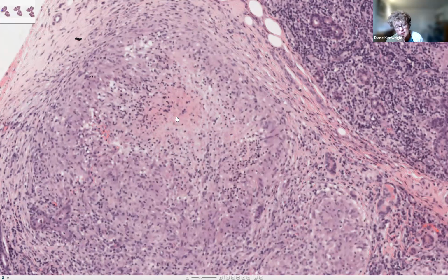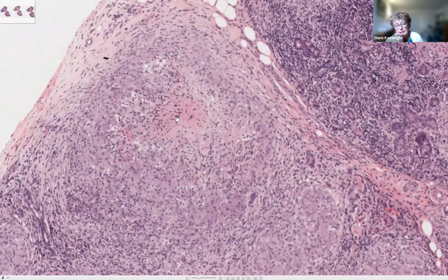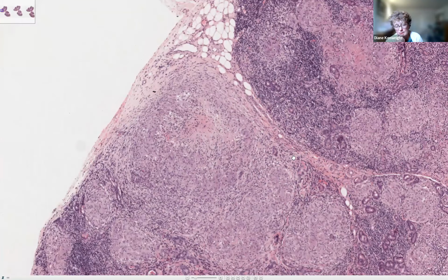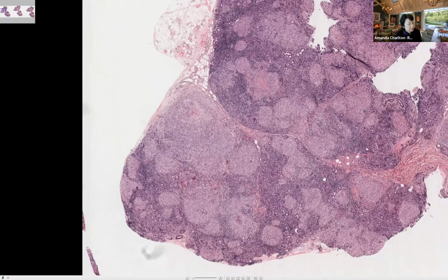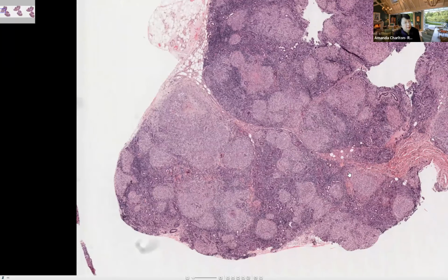And so we would always correlate this with the clinical situation of the patient. So I was explaining to people in my group that when we think of granulomatous inflammation, to go down that diagnostic decision tree about necrotizing versus non-necrotizing, not just to jump to granulomas equals sarcoid.